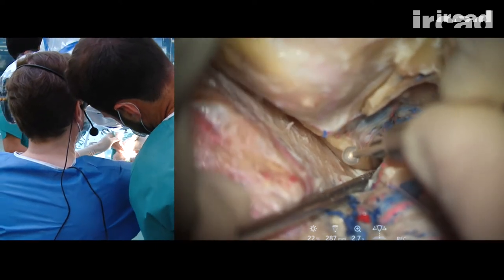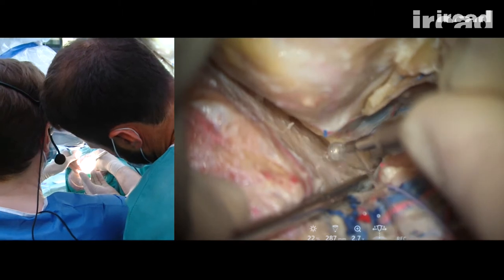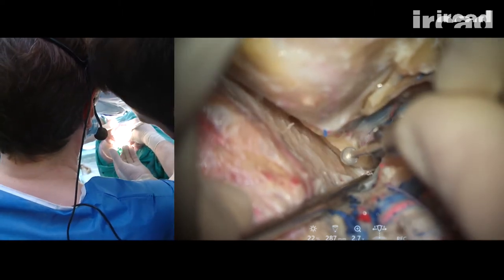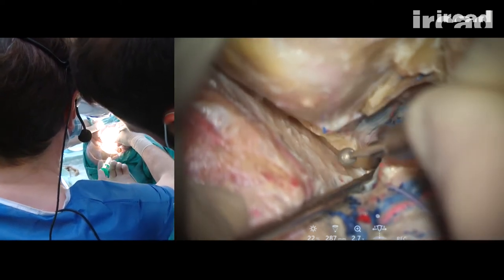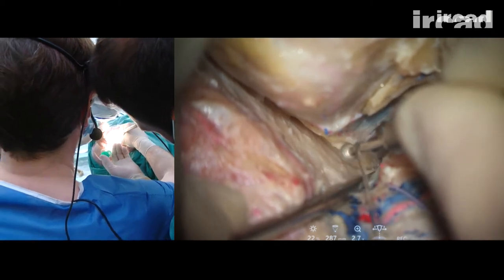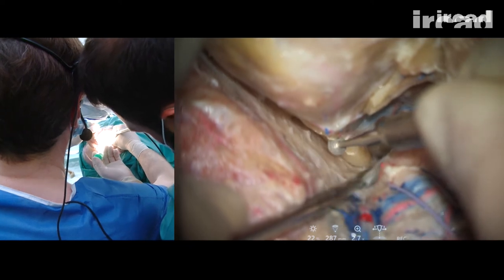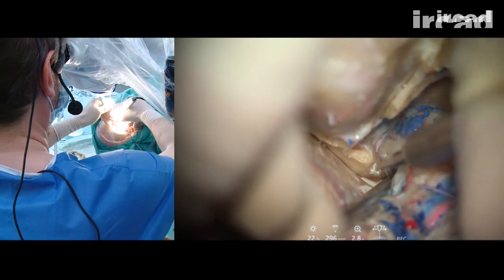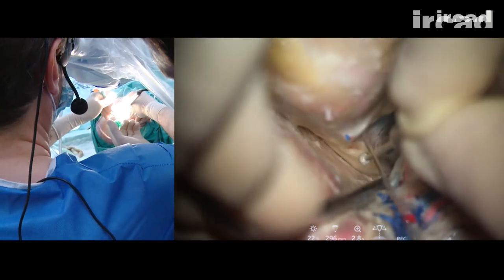So the clinoidectomy, you should start in the base of the clinoid process, to get into the volume of the clinoid. I cross suction and drill to protect.